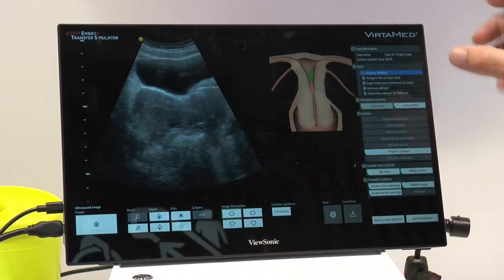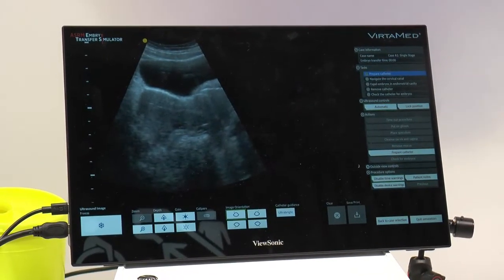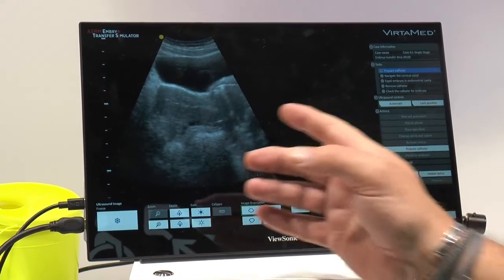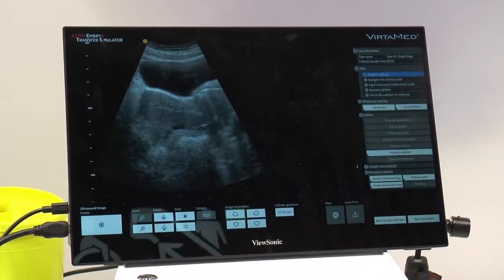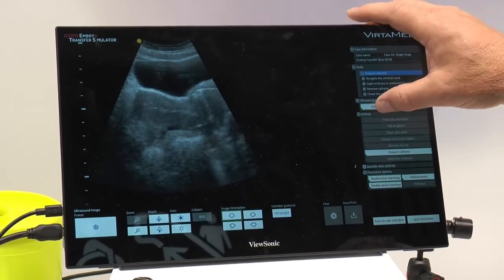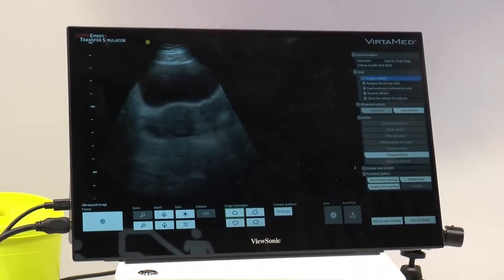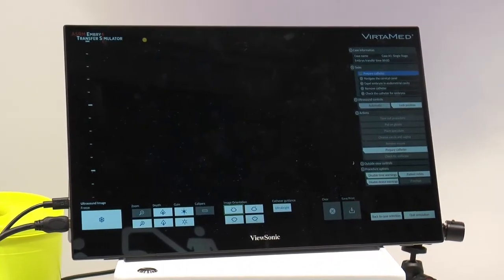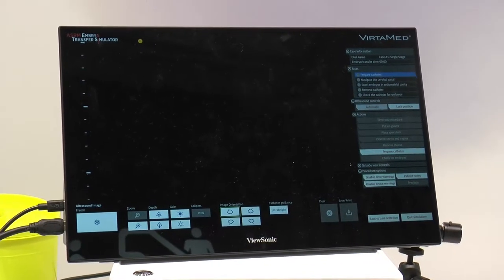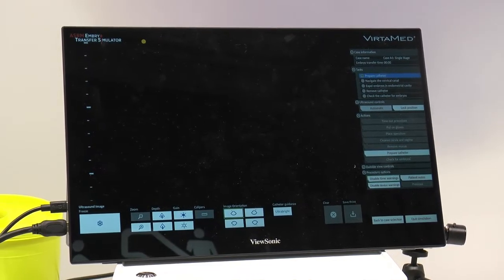Then I'm going to turn this off. So I'm going to turn the outside view off. Now, when I do the transfer, hopefully I've learned from the first view that I've done. Now I have to do it just looking at the ultrasound picture. Ultimately, then I'm going to turn off the automatic scanning, and I'm going to have somebody to help me do that. So we work through this process with a very simple anatomy, and then we build it up to the more and more difficult cases that fit into this model.